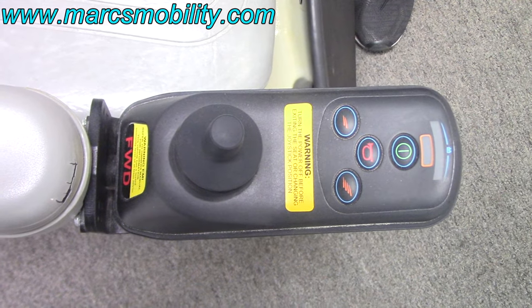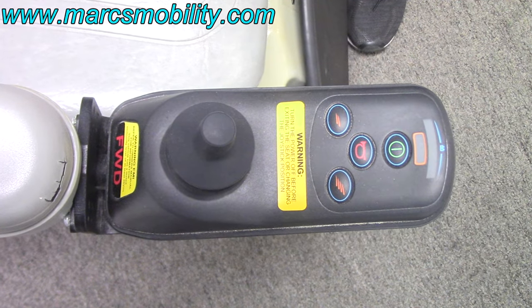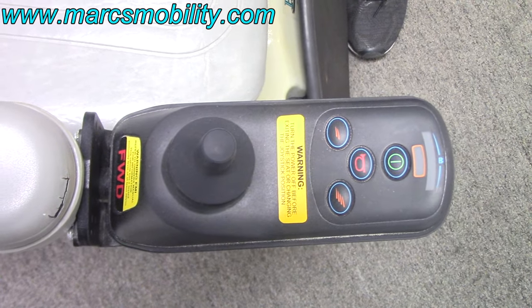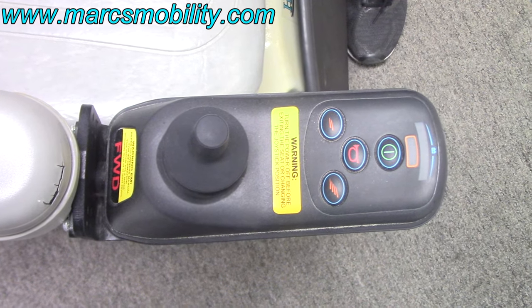This is a common joystick called a VSI joystick. It's common on a lot of older chairs. What we're going to do today is show you the different fault codes and also how to lock and unlock the joystick.